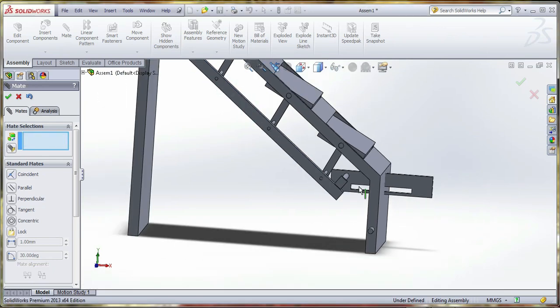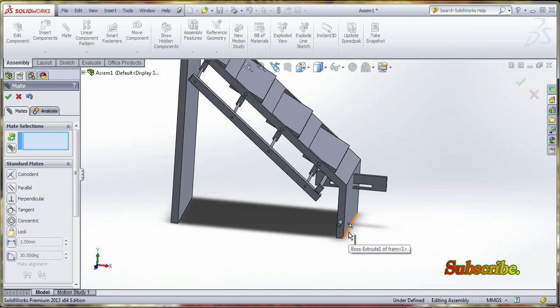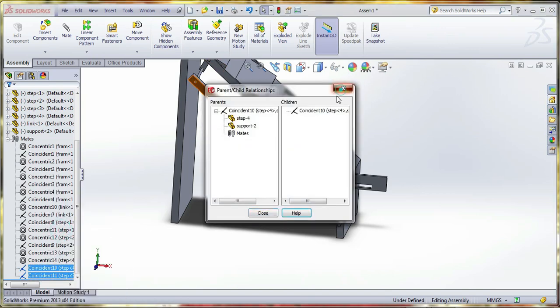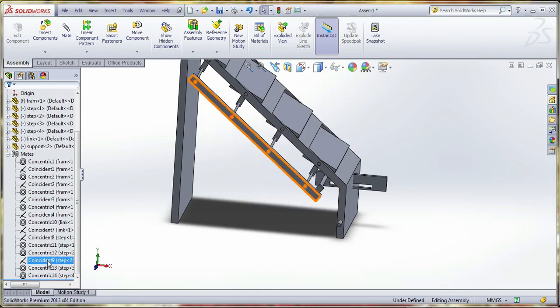Now a small correction, the pin is coming down. That is what we will assemble, this side pin, the frame pin. So you can delete. How can you edit the mating surfaces? Going to select and delete, or otherwise reconstrain.